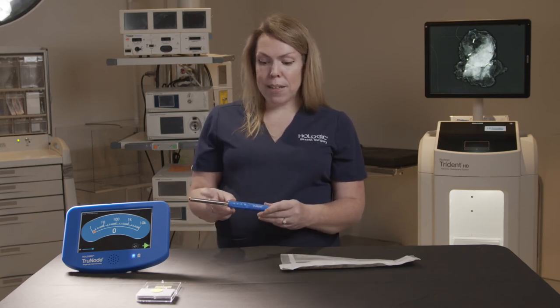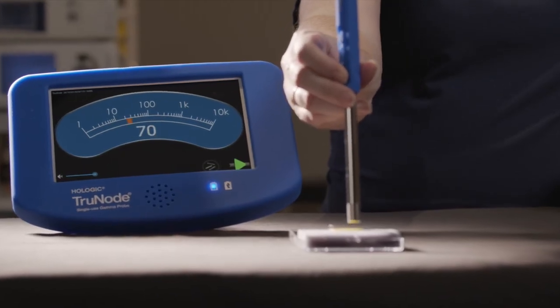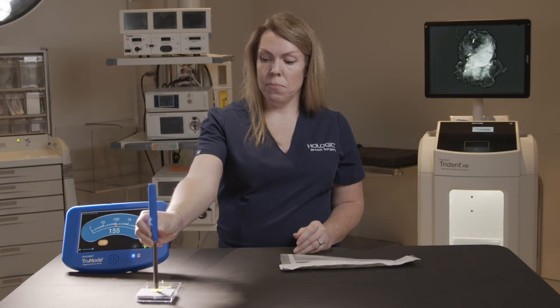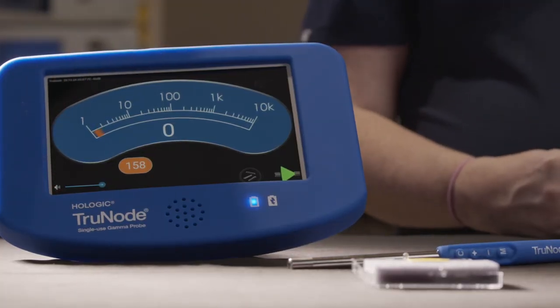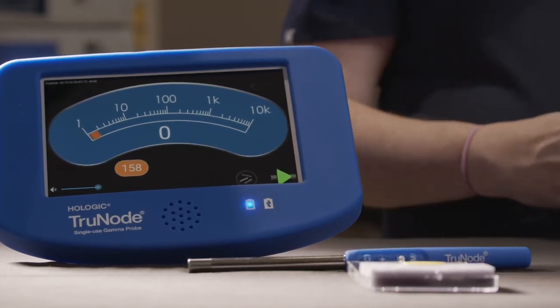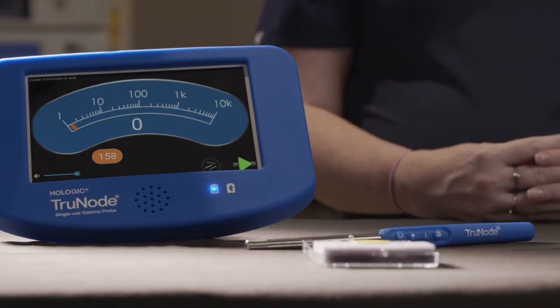By holding in the C button we're actually able to generate an average count. As you can see now that I have my average count, it's actually been recorded on the screen and it will actually stay there until the end of the case. It's very nice because that way you don't actually have to call out to the circulator in the room what the average count is — everything has been recorded and is being logged on the screen in front of you.